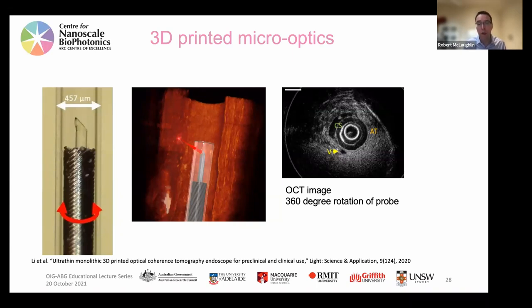So we're within 1 or 2 millimeters, or make these sorts of flexible probes that actually go inside blood vessels. Like I said, the approach of just getting close enough to the thing you want to see is what's allowing us to bring OCT to a whole lot of new areas. Clinically, OCT is used really commonly in ophthalmology. The eye is great, right? Every major hospital is going to have a few OCT systems in their ophthalmology unit for looking at the eye. The eye is great because light goes through the eye, which is why you can see. Clinically, it's also very commonly used for cardiology, for looking at atherosclerotic plaques. And what we're enabling by making these small probes that we can poke into places is suddenly taking this ophthalmology and cardiology technology to a whole lot of diseases where we just haven't been able to get the light to before.